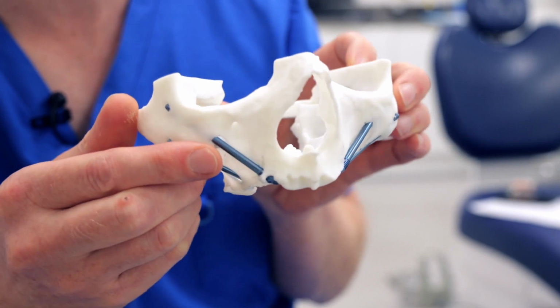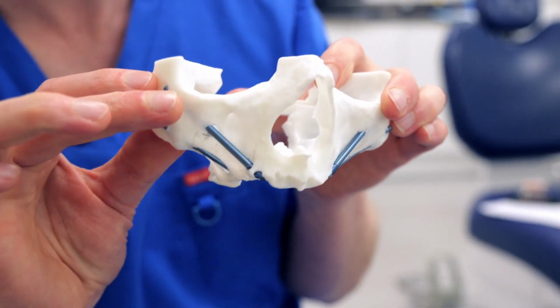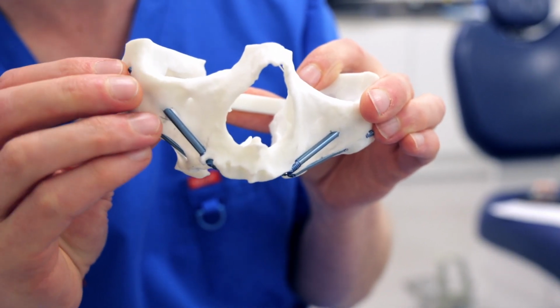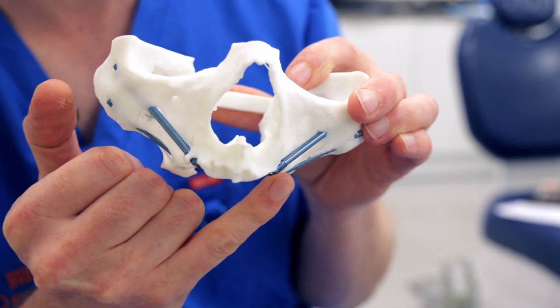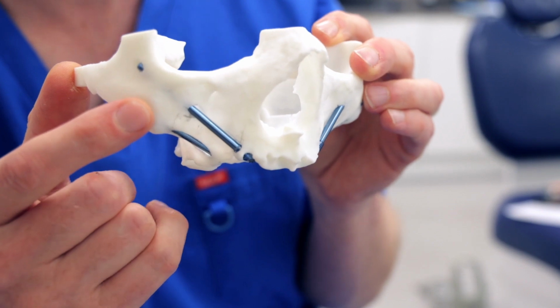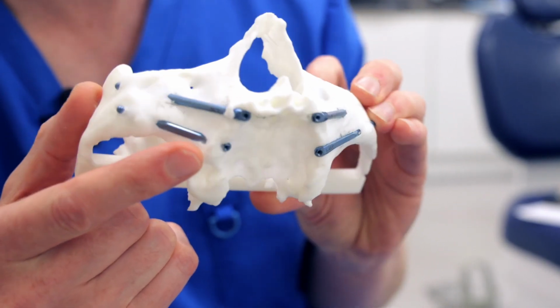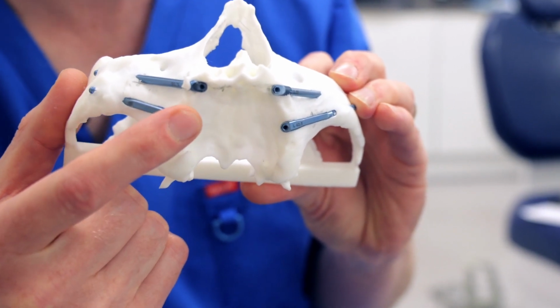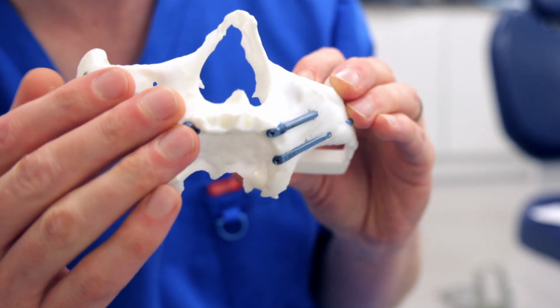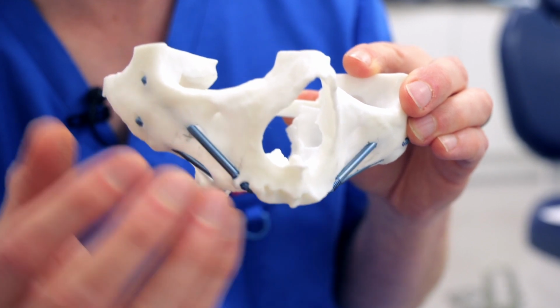And you'll see these little blue things here, these are replicas of zygomatic implants. So the zygoma is this bone here, this is your cheekbone. And when we don't have enough bone in these areas where you'd normally find your teeth, what we do is we provide longer implants at an angle so that they insert into the dense zygoma bone. And then the tops of the implants come out here, normally where you have your teeth. All this is covered over by gum, you can't see that or feel that. And then we make a fixed set of teeth that go exactly on top of those implants.